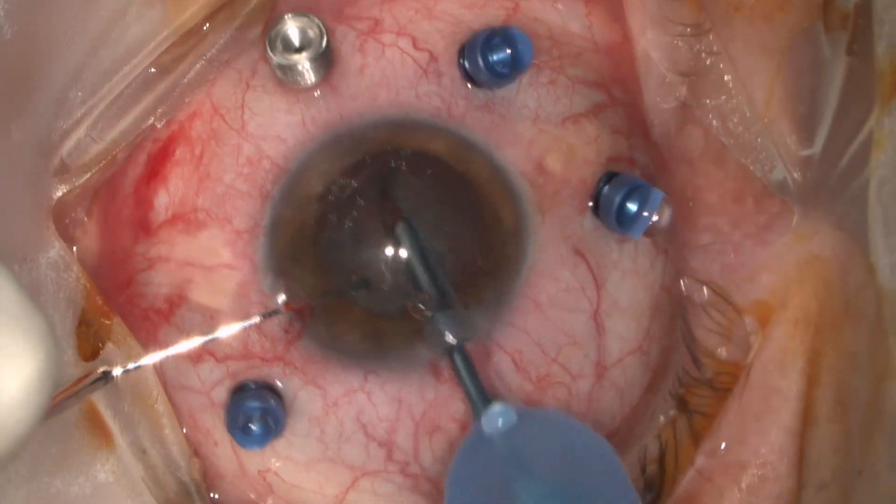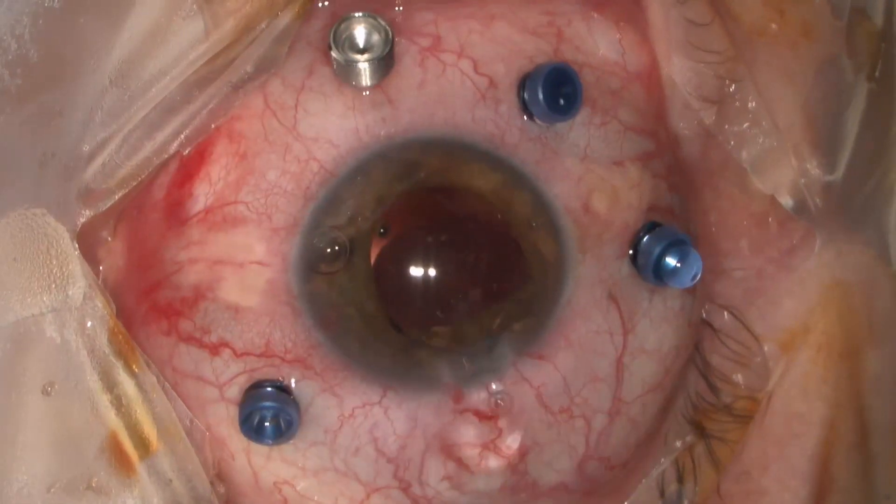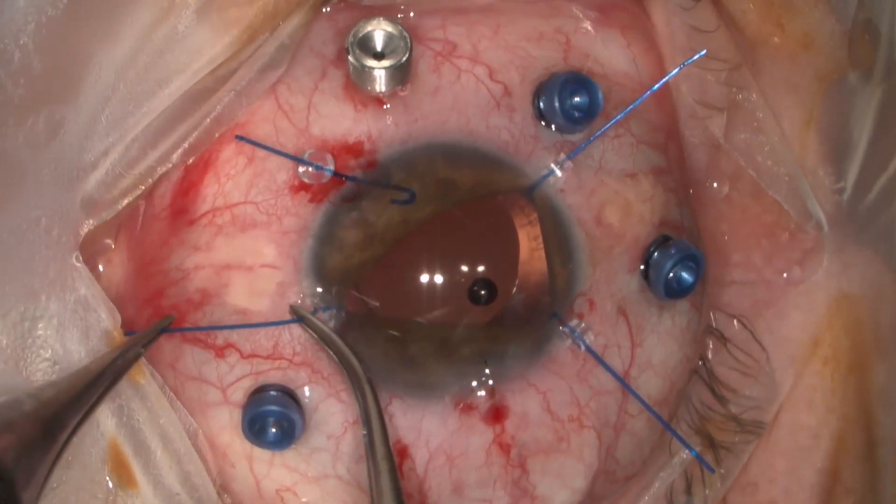The preoperative visual acuity of this patient is 1 over 100, as the macula of this 61-year-old man is off. A combined surgery is decided with a 25-gauge setup.